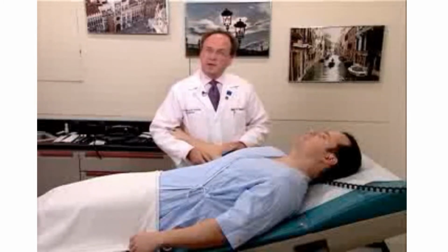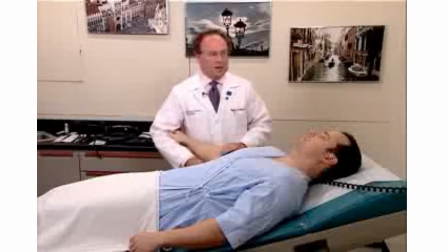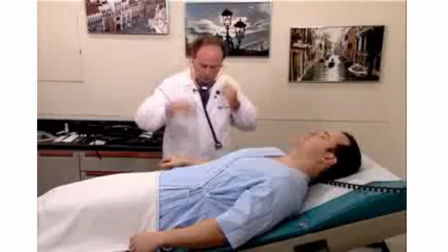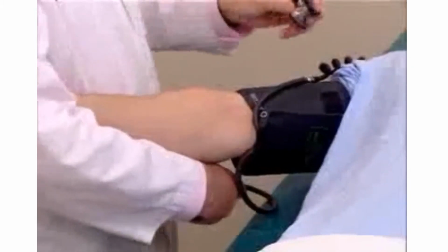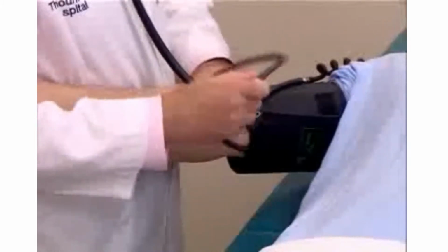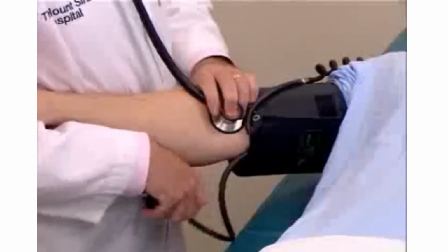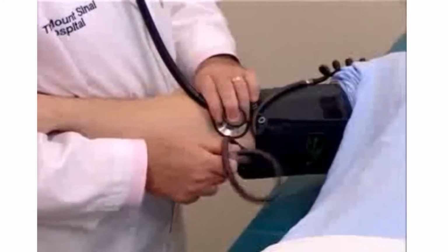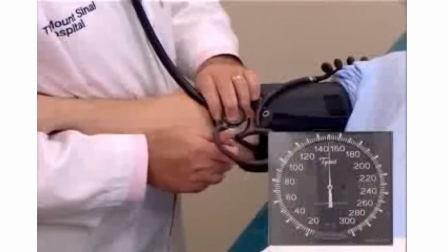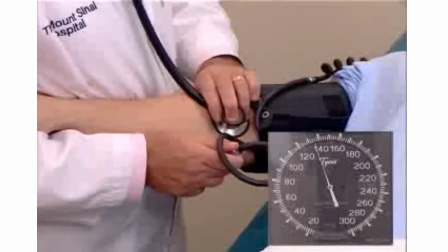Now, after we've ascertained the peak systolic pressure, which was about 120 in Mr. Johnson's case, we will now do blood pressure by auscultation. What we will do here is place the diaphragm of the stethoscope over the brachial artery and blow up the blood pressure cuff to about 15 or 20 millimeters higher than that which we palpated. So I'm going to blow up the blood pressure cuff now to about 140, and now very slowly I am going to reduce the pressure.